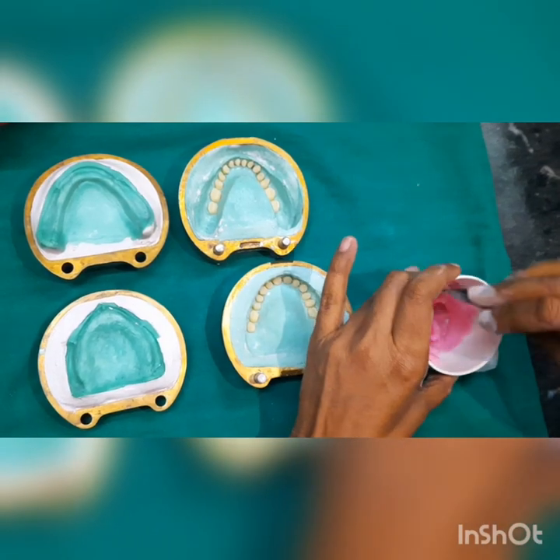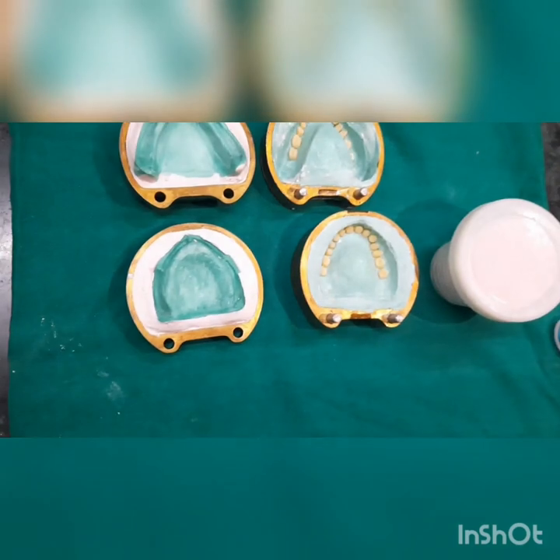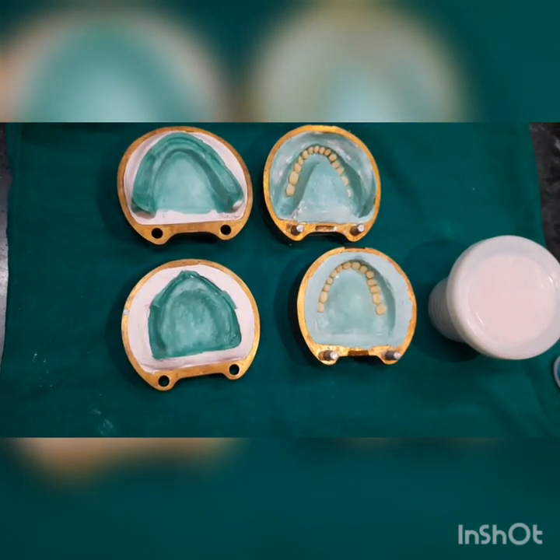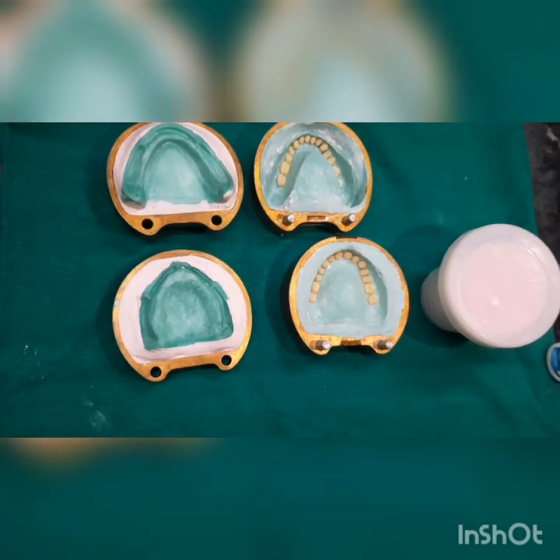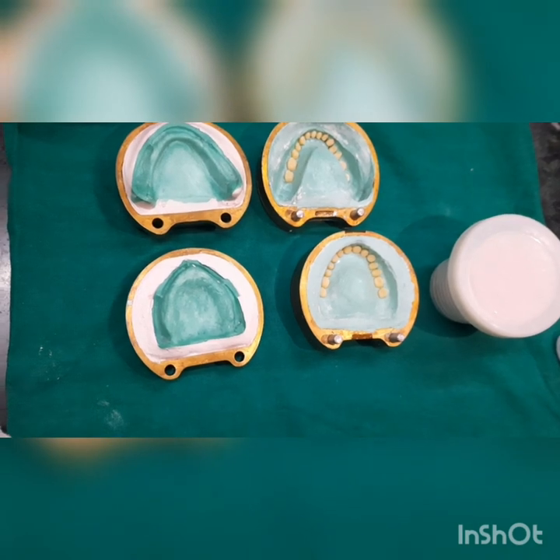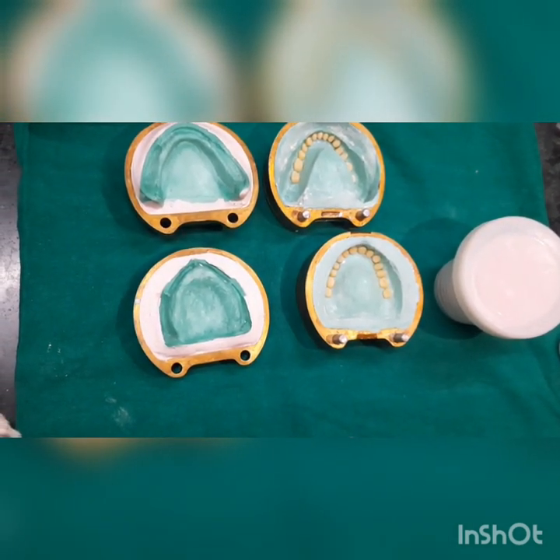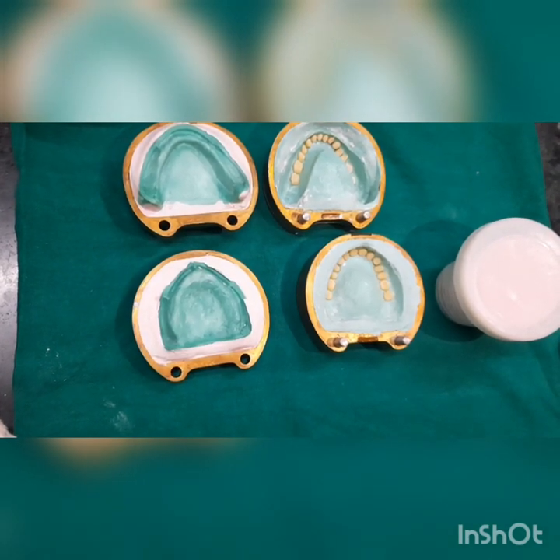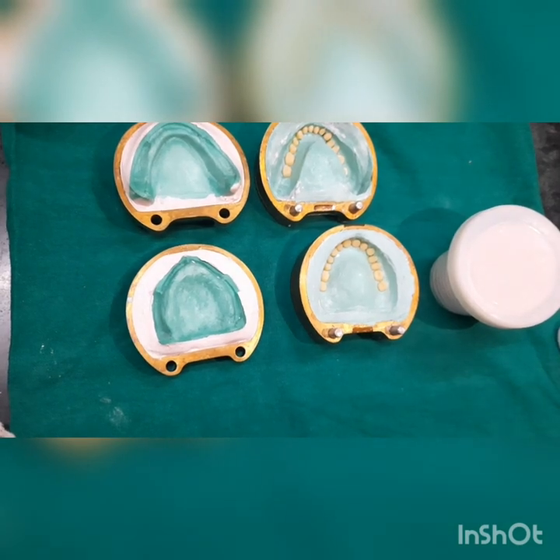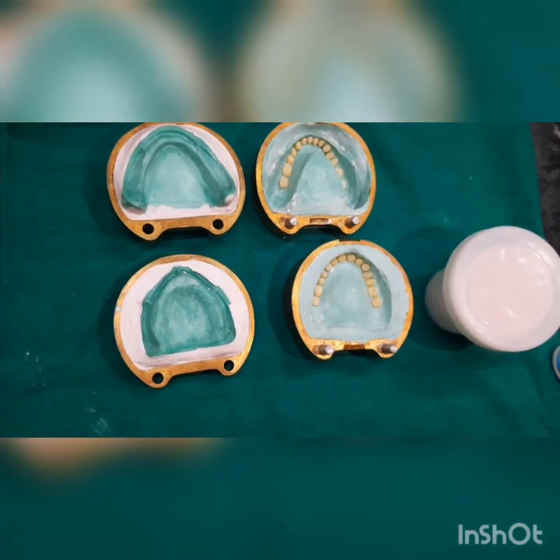Whenever we are mixing the polymer and monomer, there are five stages. The first is the wet stage, in which the monomer and polymer are mixing. The second is the stringy stage, in which the viscosity of the mix increases and it becomes sticky and stringy.